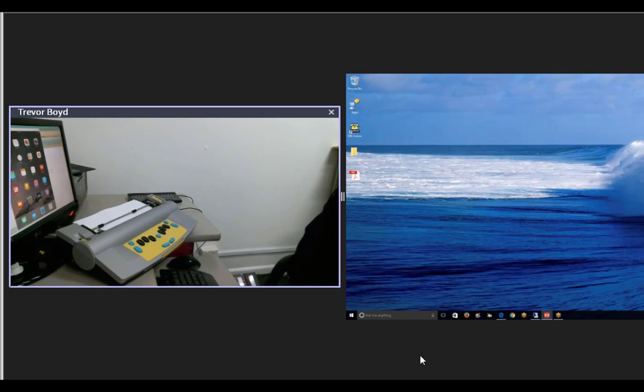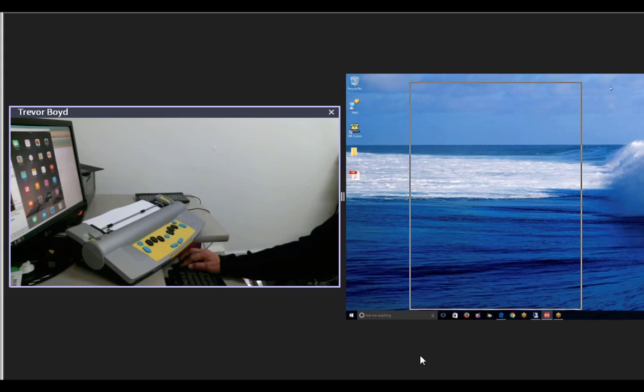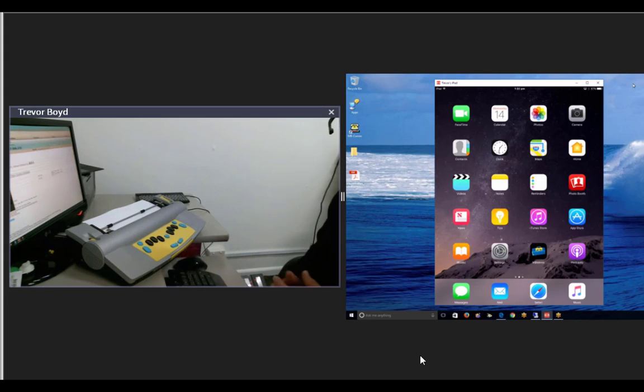So what I've done there is simply exited the MB comms on the computer and removed that USB cable. And there's 2 other ways of accessing a Mountbatten externally. One of them's on a standard phone, or I can do it on an iPad.